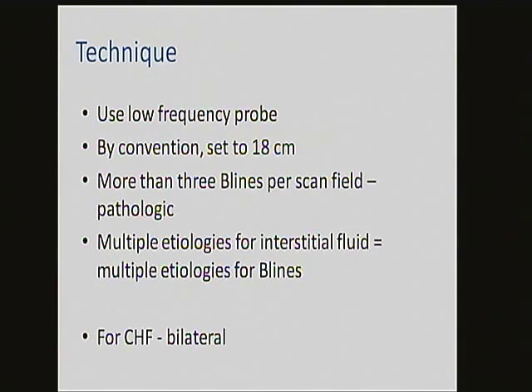Now remember, not everything that fills up the interstitium with fluid is CHF. So you still have to be a doctor and know if the patient has pulmonary fibrosis or has a bad pneumonia or has something else going on that can cause the interstitium to fill up with fluid. But it's very useful in the patient who has both COPD and CHF and comes into the emergency department wheezing. And we know what we usually do. We usually give them steroids, Lasix, albuterol, and Atrovent, and they get all of it.